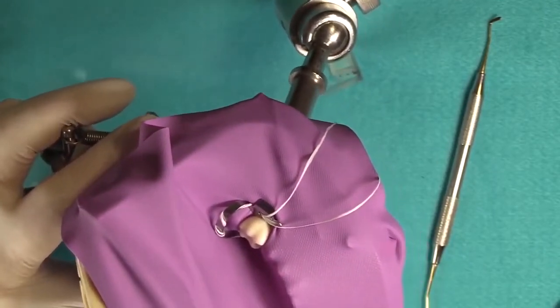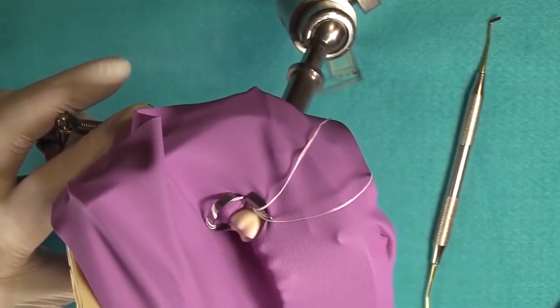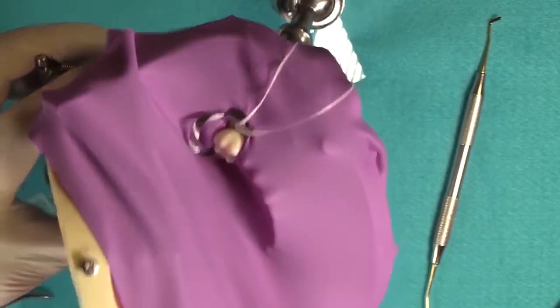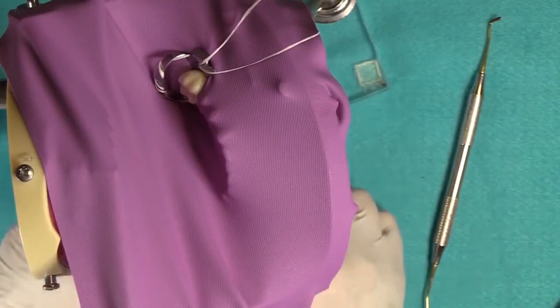Obviously, single tooth isolation, you could be doing either an occlusal, or you could be doing, well, your most popular treatment would be root canal therapy. And sealants is another option too. The clamps I usually use for sealants are part of the Dr. Brinker series. Those are the B2 and 3.